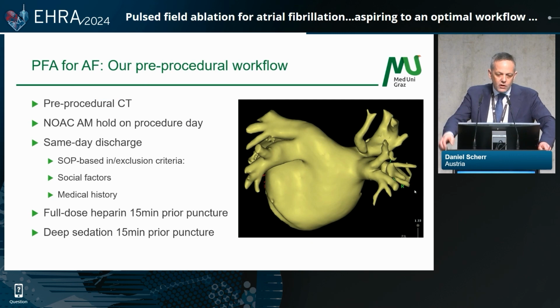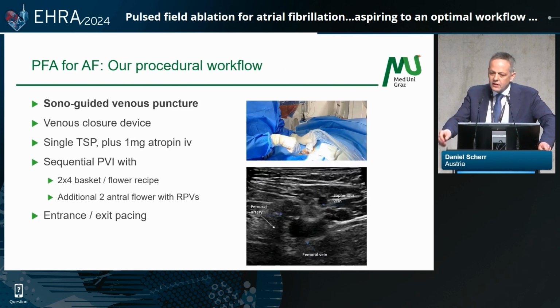Now, to continue on our own workflow, we give full-dose heparin 15 minutes prior to the procedure, and we initiate the deep sedation with propofol also 15 minutes prior to the procedure, before we puncture the vein. Now, our workflow further consists of a sono-guided venous puncture, and I think this is mostly standard all across Europe.